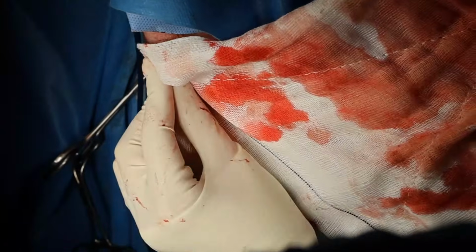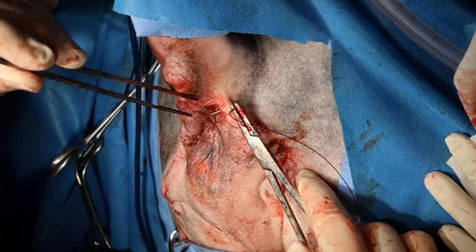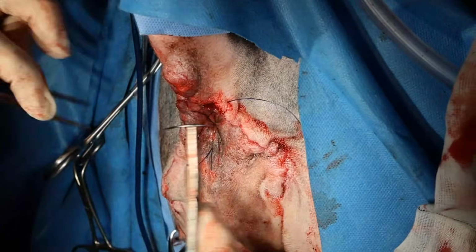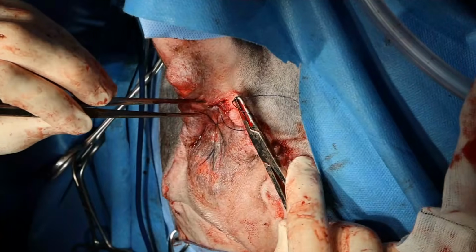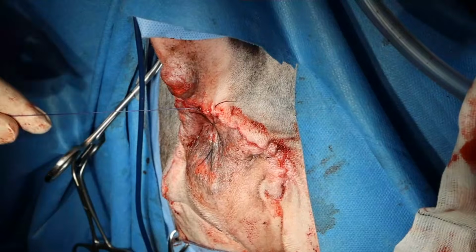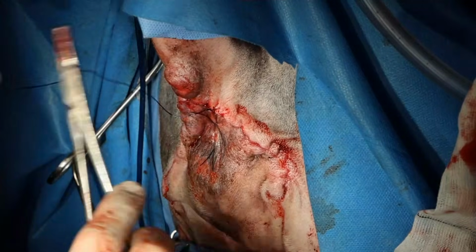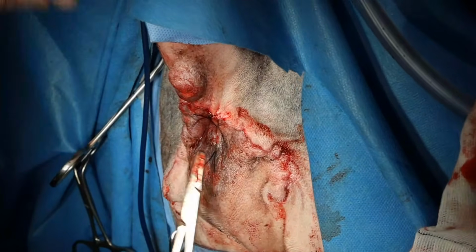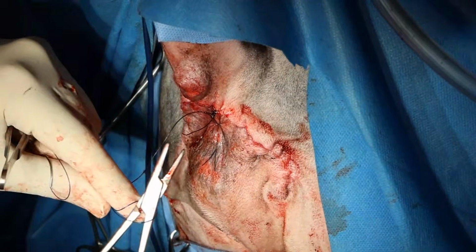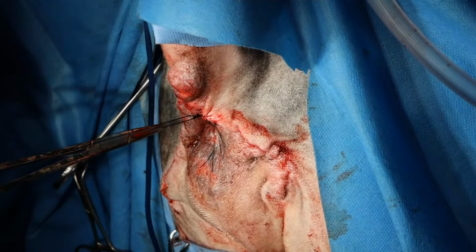It's not the prettiest bottom. Just putting in a little cruciate suture here that we'll have to remember to take out. It's interesting how asymmetrical this came out. I thought that I was going the same distance down on both sides. Well, the end is still in the middle. I think that's good. It's not pooping to the side.